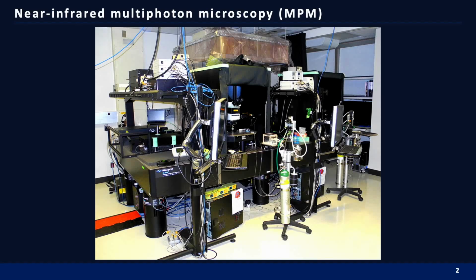Here you can see an example of a multiphoton microscope. As you can see, it is as big as a room. The laser path is on the hydraulic table, and in this case the microscope has two systems for the parallel acquisition by two different users. There's a heat stage where the mouse lies during the acquisition, and the mouse is kept asleep by the continuous administration of isoflurane. And in this picture you can see the isoflurane unit as well.